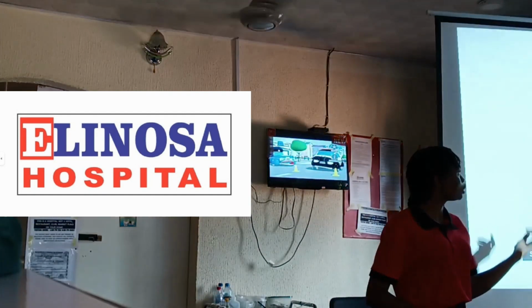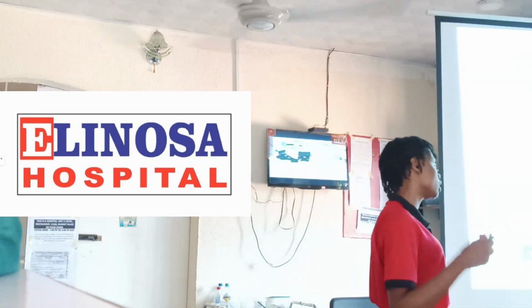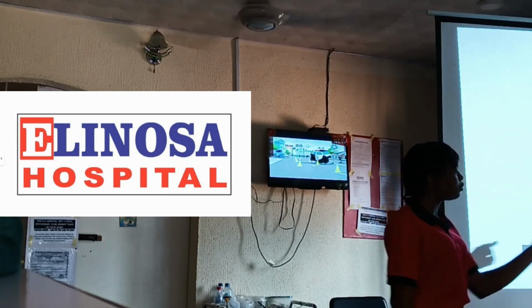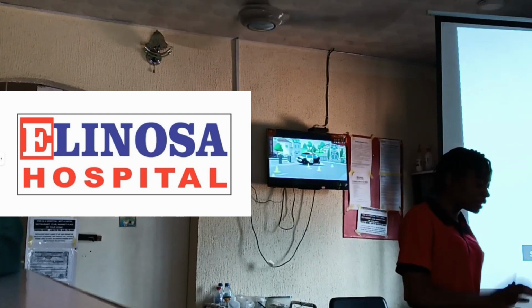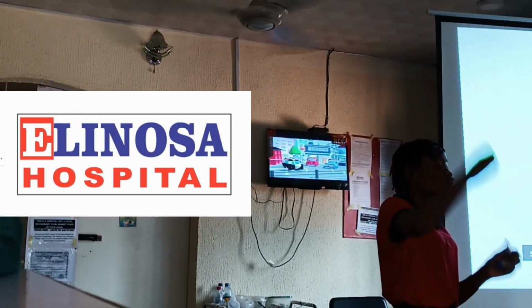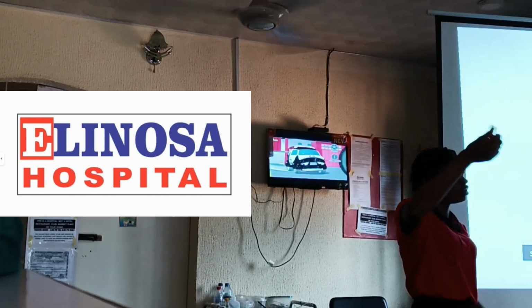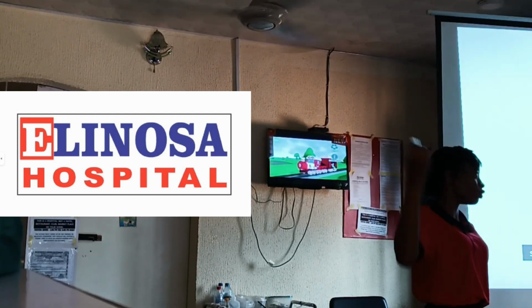So when you withdraw blood into a syringe and leave it for a longer time, like an hour or even 30 minutes, it will clot. That's the reason why we normally put it inside EDTA. Why? Because it contains an anticoagulant. Now this is a plain bottle. If you want to run a serum calcium test, for example, you need to use this plain container. It is called a plain container because it does not contain any form of anticoagulant that prevents blood from clotting.